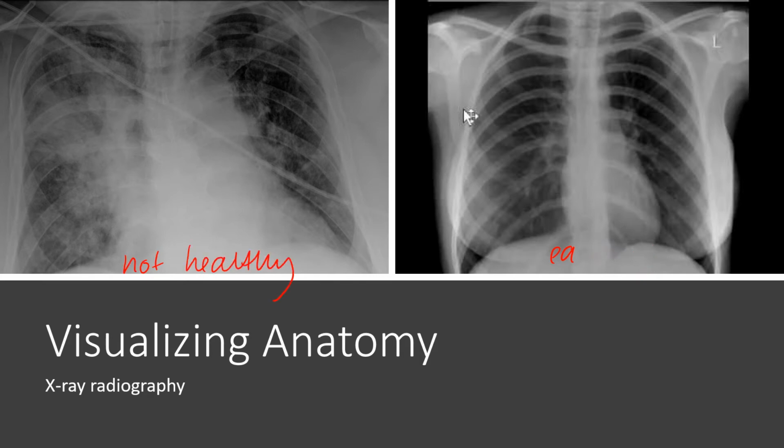Take a moment and look at these pictures and tell me how you might be able to tell that the lungs of the left X-ray are less healthy. Just to keep reminding, this is less healthy, this is more healthy. All right, so what's wrong with this picture?